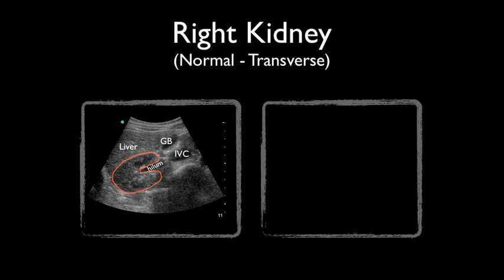The renal cortex and pyramids are found on the periphery of the kidney and appear grainy. The central area of the kidney, the renal sinus, will appear bright and consist of the calyces, renal pelvis, and renal sinus fat. It is a good idea to always scan both kidneys for comparison.